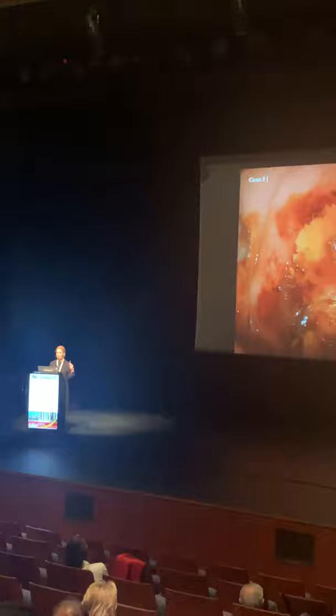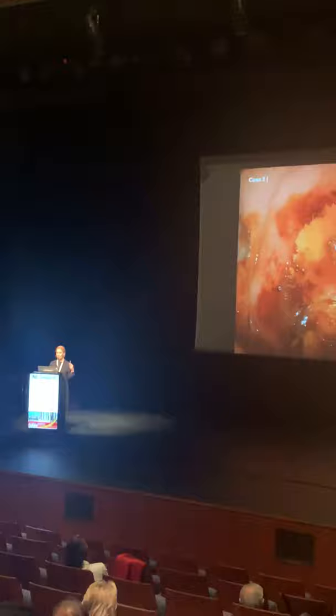This is the image after application of Lugol's solution. What is your opinion?